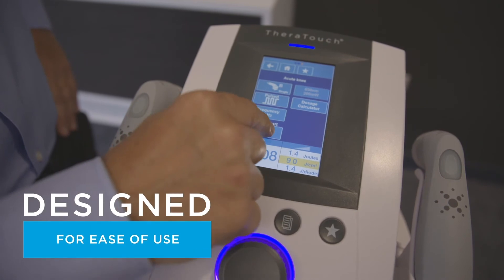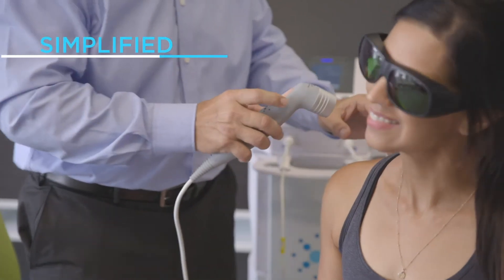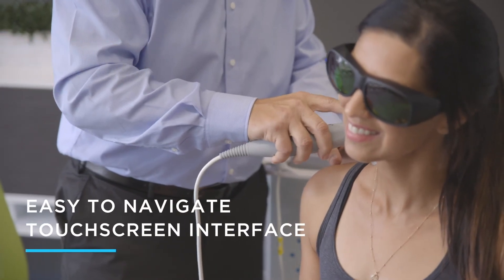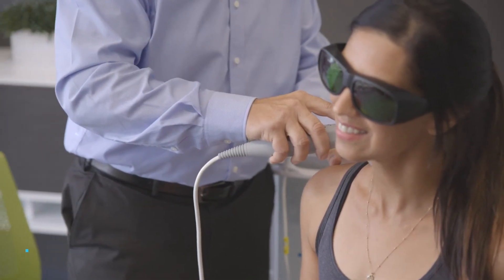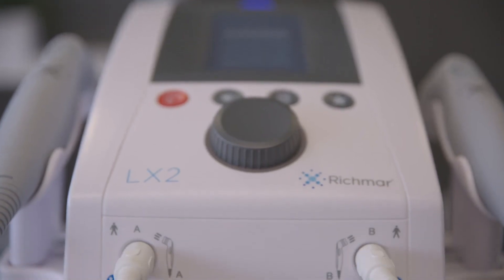Theratouch LX2 is designed for ease of use, including simplified terminology in an easy-to-navigate touchscreen interface to make administering care faster and more productive.